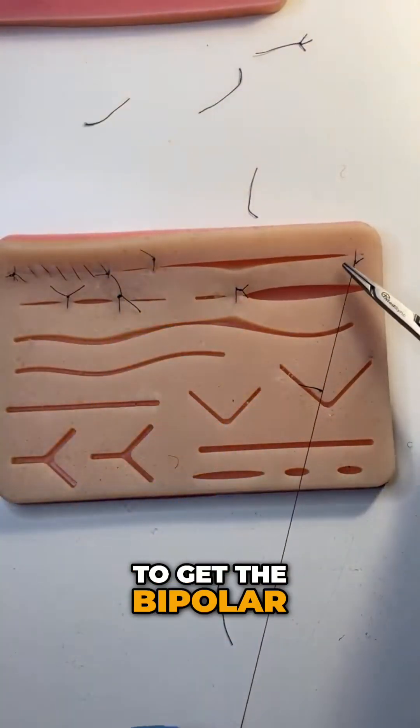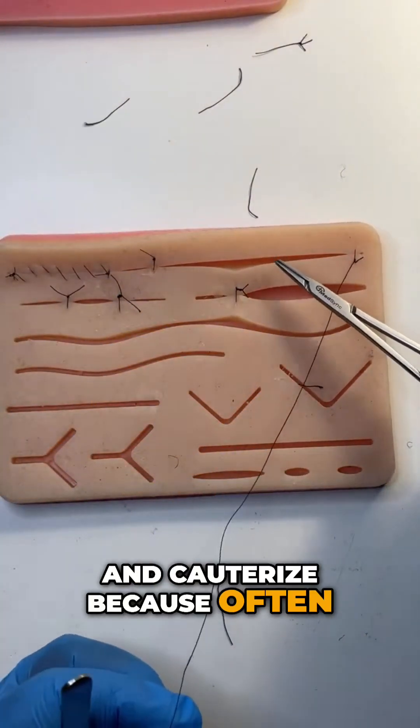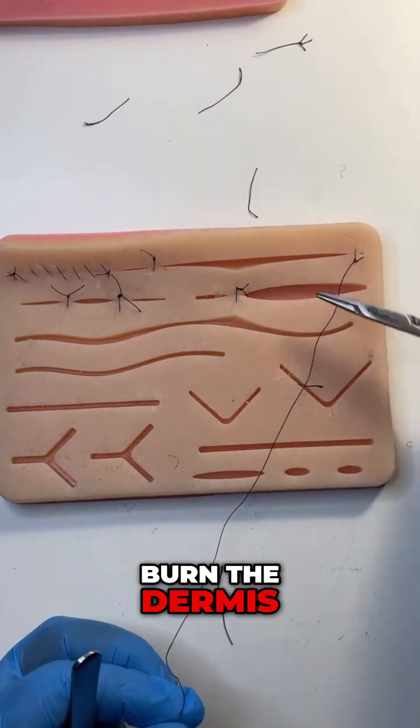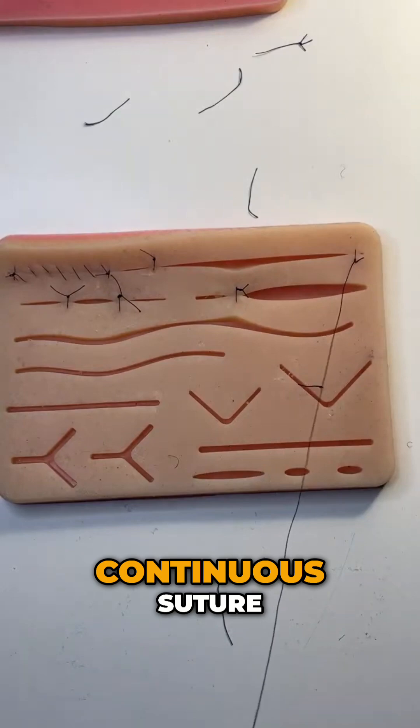But you don't want to get the bipolar and cauterise, because often that bipolar cautery will burn too superficial. You don't want to burn the dermis. So I do a continuous suture.